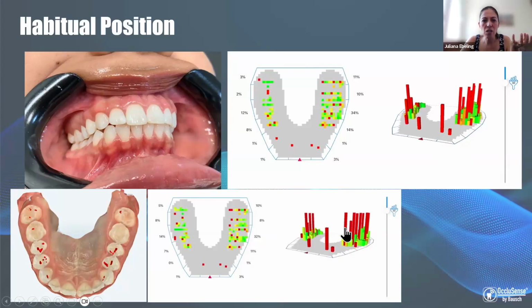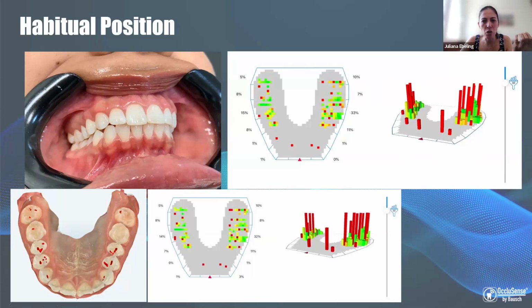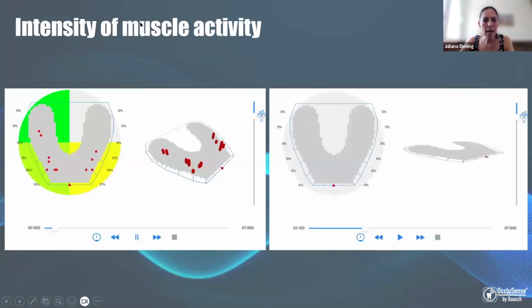This situation is a picture from this whole movement. This is the difficulty when clinicians want to use all of these devices together without understanding what they are capturing with these different devices. Okay? And what is the second point that we need to have in mind?